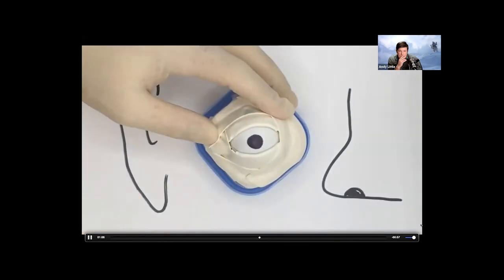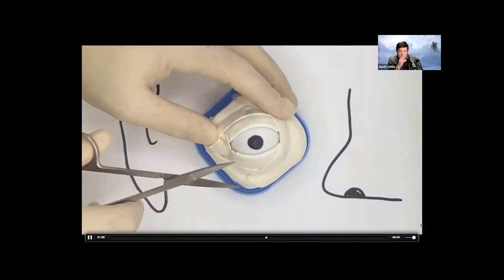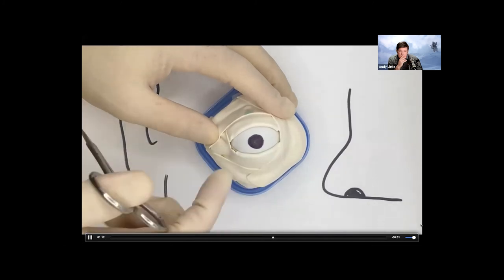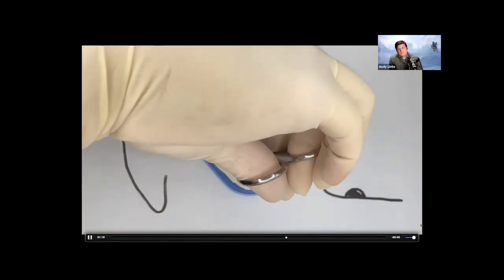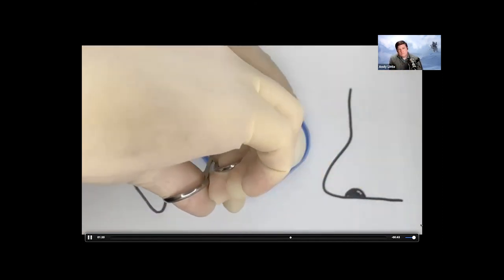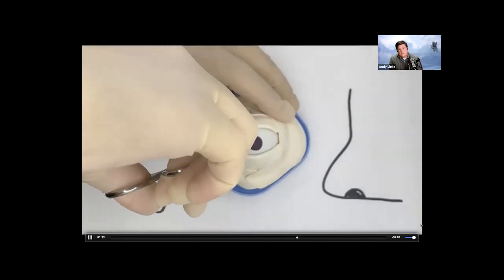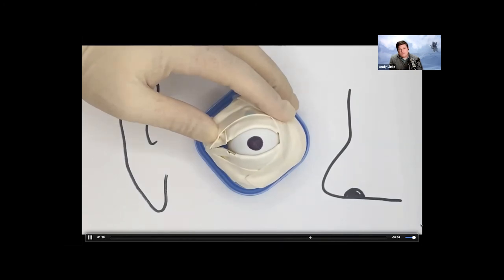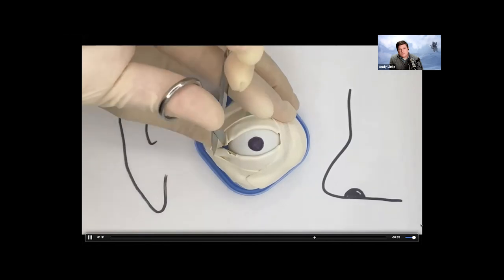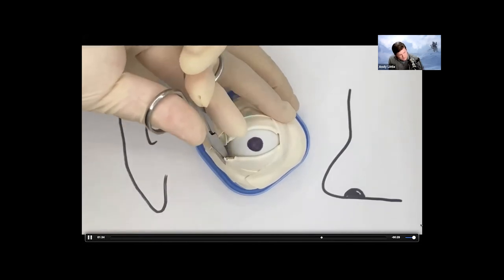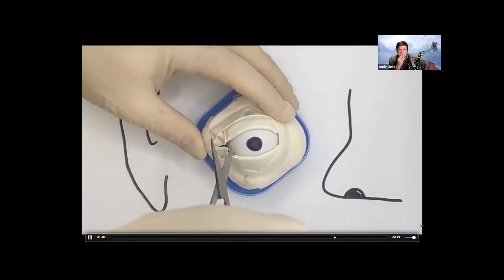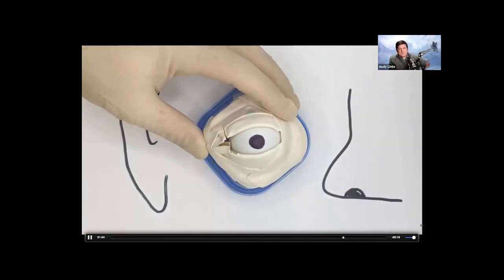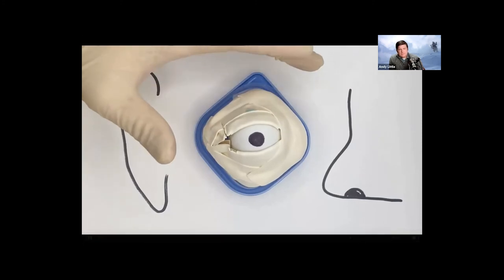Once you let the clamp be there for 5 to 10 seconds, you're going to take the clamp off. Make sure you have a good indentation, and then you're going to use your straight scissors from your laceration kit. Again, everything you need is in your laceration kit. And you're going to make a straight down cut through the lateral canthus, attempting to release the eye. Once that cut is done, you're going to reevaluate the patient, and that reevaluation can be done based on a pressure change in the eye or by a reevaluation of their symptoms. If these are unchanged, we're going to move on and cut the inferior crura by making a 45 degree incision from our original incision. And then if, worst case scenario, it does not improve even again, hopefully by now ophthalmology is at the bedside, you can perform one of the superior crura as well.